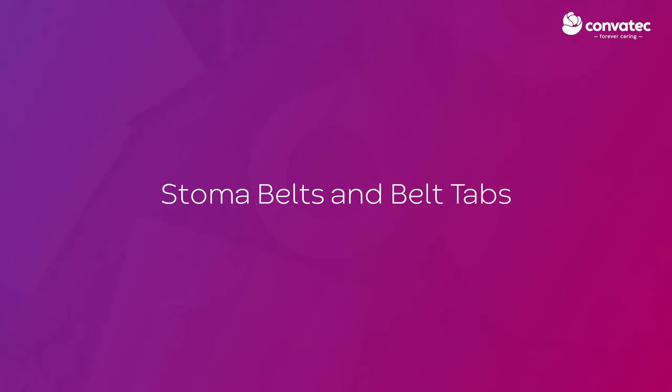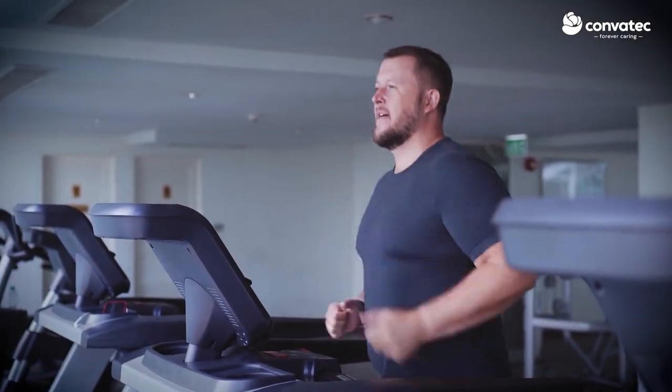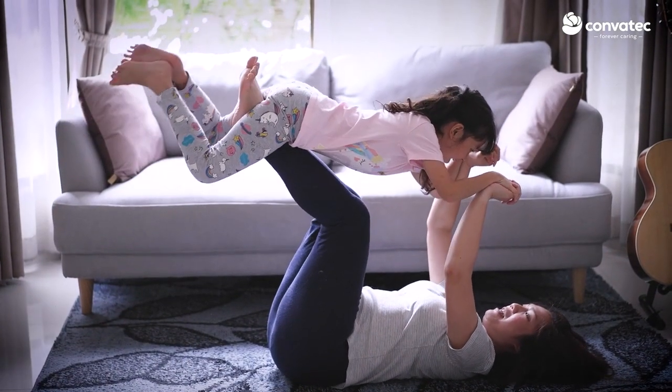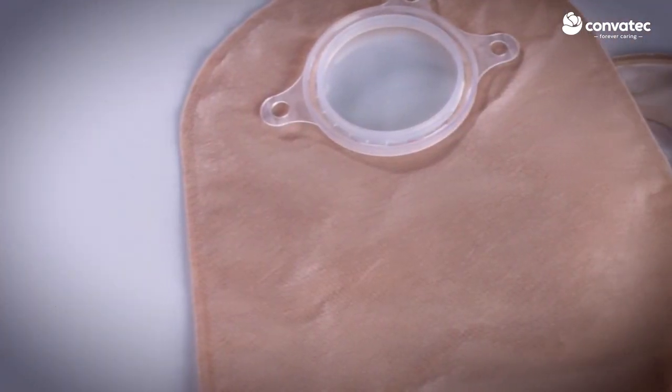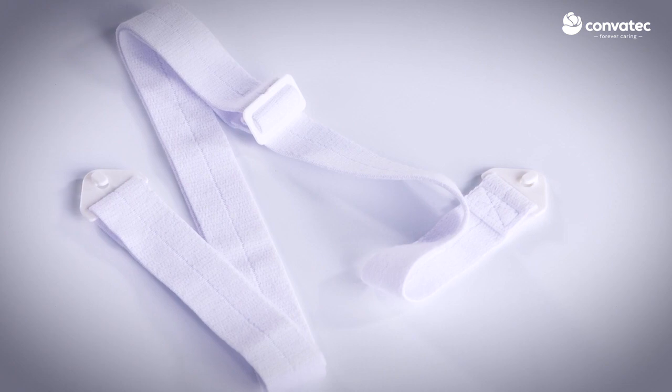A stoma appliance belt may help to stabilise your pouching system, providing additional security as you go about your daily activities. Pouching systems with belt tabs are required in order to attach a Convatec stoma belt to your pouch.